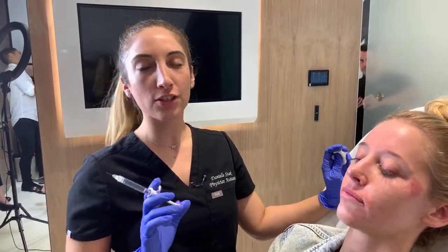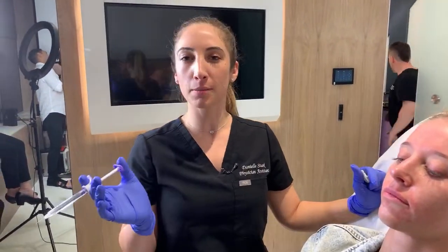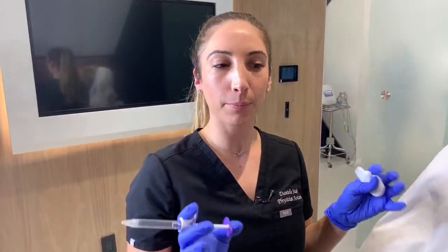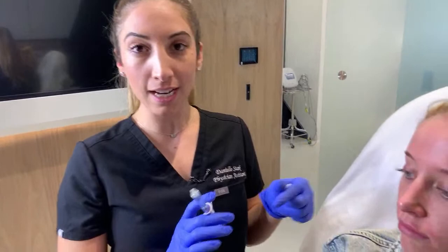So I just started on the lips. It's super important to me that we communicate what we do and don't want, and everyone's look is different. The idea of what beauty is now versus classic beauty has changed. Our proportions have shifted a little bit. And just like anything, there's trends in fashion, there's trends in beauty. So we started injecting just a tiny little bit on the lip.